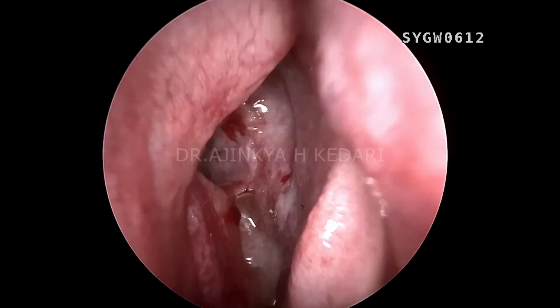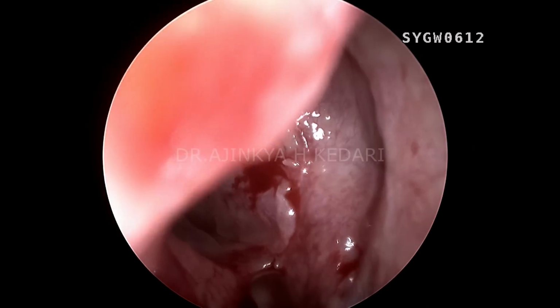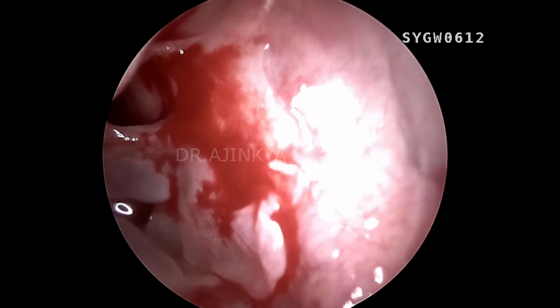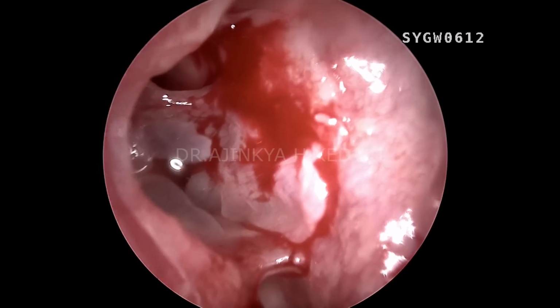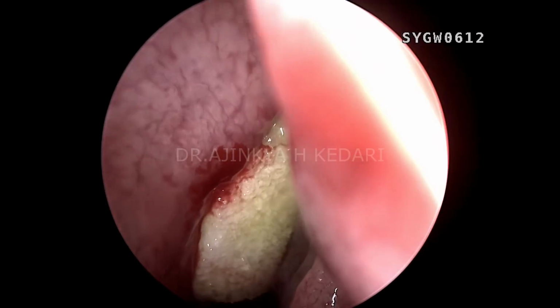So again, I'm going to go for decongestion, to reduce the edema of the mucosal surfaces. You can see there's a huge area of the middle meatus, and you can see the CSF pouring out from a particular area in the frontal recess. Little bit of capillary ooze, that's fine. You can always put pressure to stop that area from bleeding. You can see mucosal hypertrophy in that particular area.